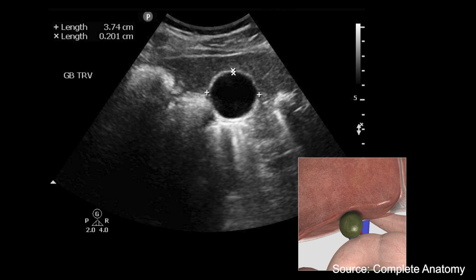So when you scan the gallbladder, sagittal and transverse are relative to the gallbladder. You try to keep it relative to the external anatomy, but more often than not, your sag is going to be oblique to get that true elongated gallbladder view. So you have to play with this a little bit, and be careful that you're getting the whole length and then looking at its width, understanding that it may not follow the rules you see on the outside.